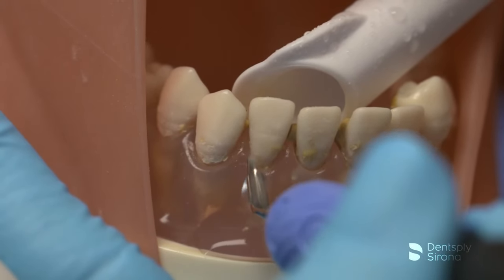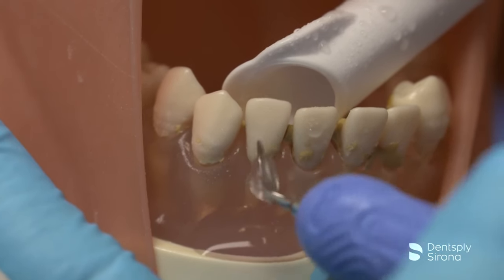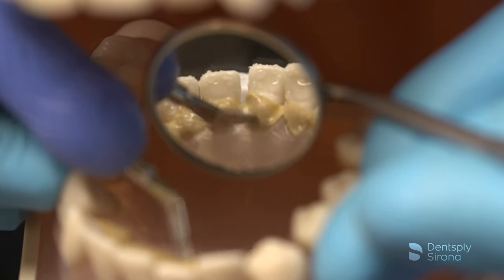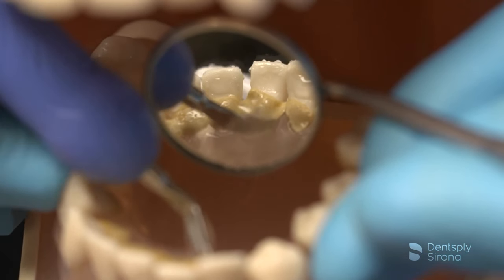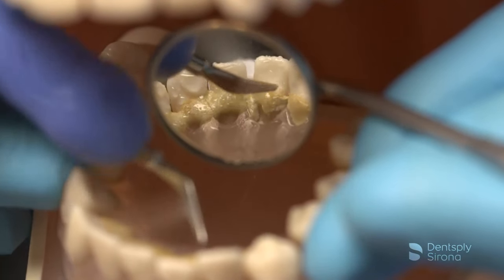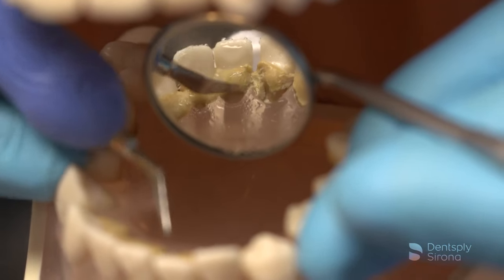Once the foot pedal is activated, the clinician approaches the deposit in more of a straight-on approach due to the blunted tip of this insert. Adapting the insert under the deposit allows the calculus to break free in large pieces, allowing for more efficient removal. There is a slight vertical stroke when a ledge of calculus is lifted from the tooth.